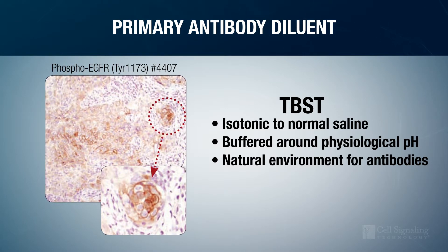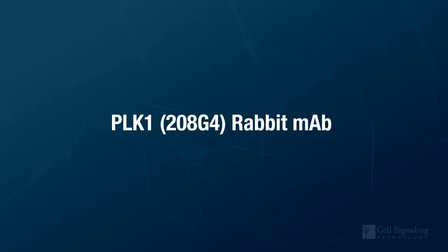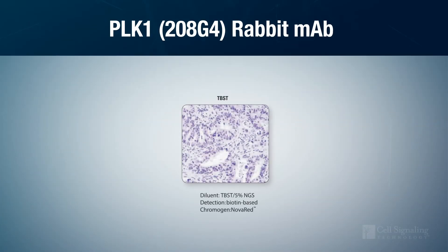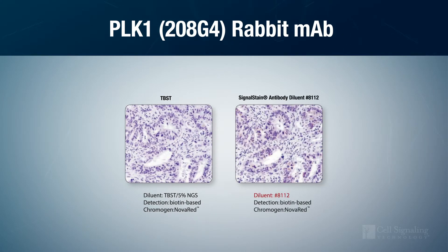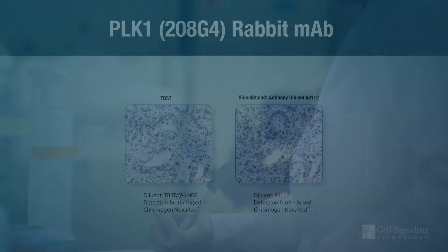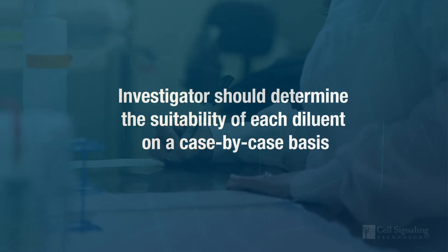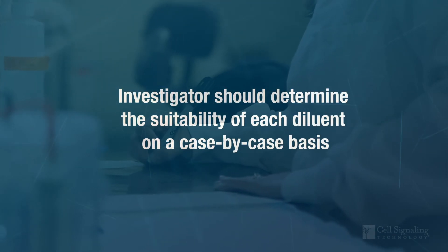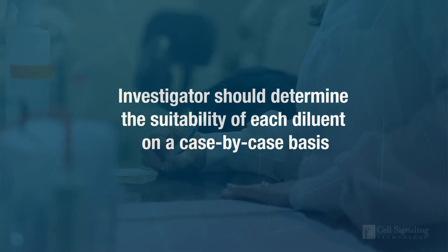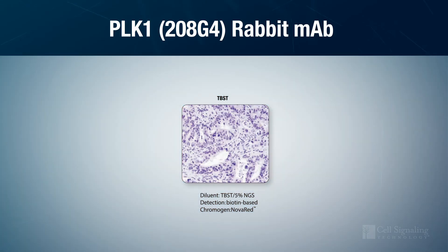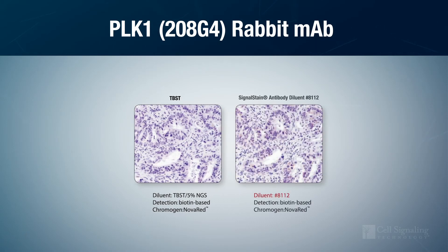But it doesn't work for all antibodies. For example, PLK-1 rabbit monoclonal antibody produced limited signal when it was diluted in TBST, but the signal slightly improved when we diluted it in signal-stained antibody diluent. Since each commercially available diluent mixture is proprietary, the investigator will need to determine the suitability of each on a case-by-case basis. For PLK-1, changing the diluent improved the signal, but only slightly.